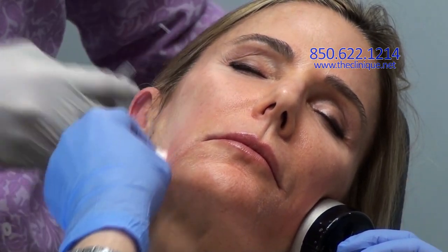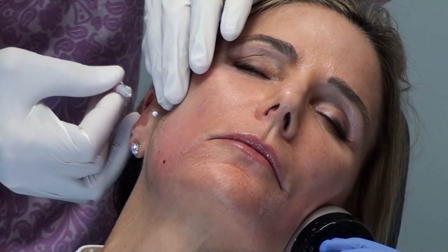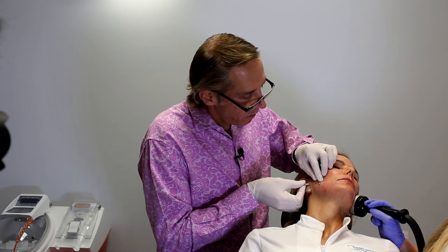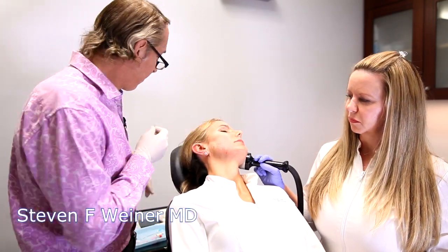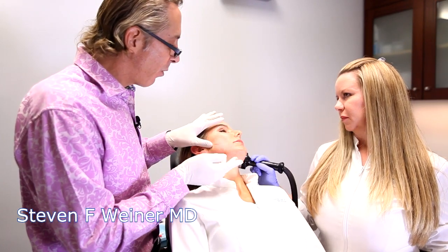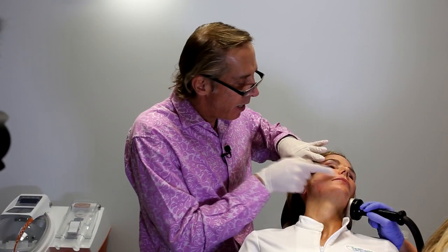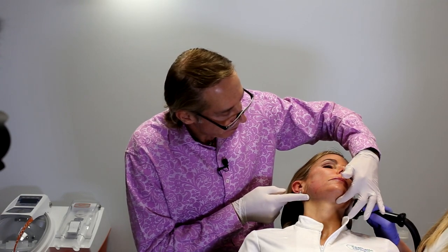I'll put in 2 more, cross-hatching it. We have cross-hatching for collagen stimulation in the crepey skin, and that's what this is. And then we have the barbs for lifting. So you can see she's got really no bleeding and no bruising. We can put some, and I won't show this, but you can put some up here to lift the cheek and nasolabial folds, and you can put some down here to help with the neck.